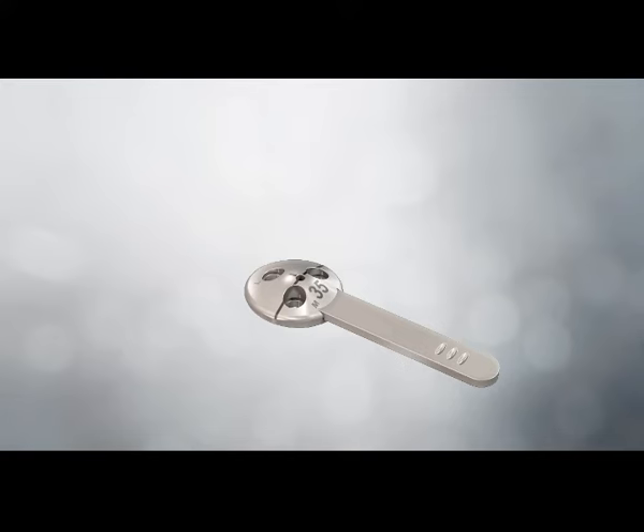For the final patella preparation, the clamp ring is connected to the modular clamp. With cement applied to the implant and the surface of the patella, the component is positioned with the clamp ring centered over the articular surface and the metal backing plate against the anterior cortex of the patella. The patella clamp holds the implant until polymerization is complete. The knee is closed using the surgeon's preferred technique.